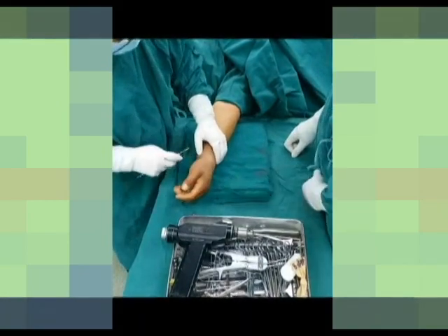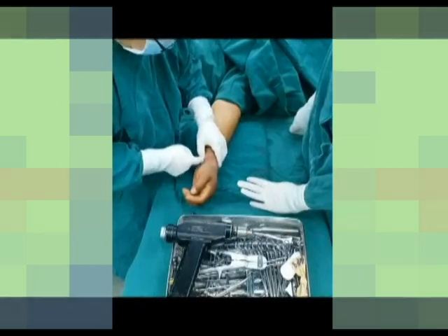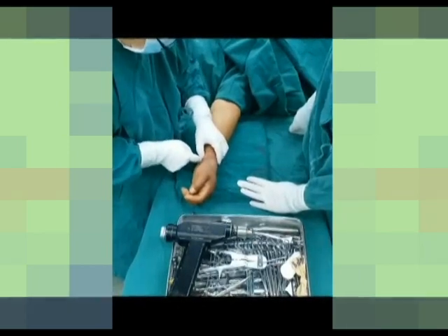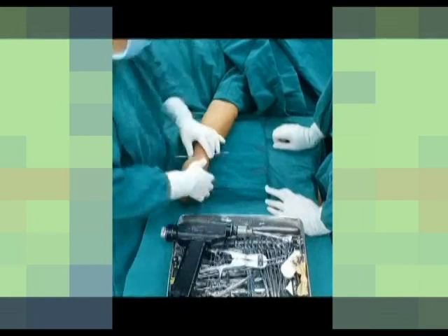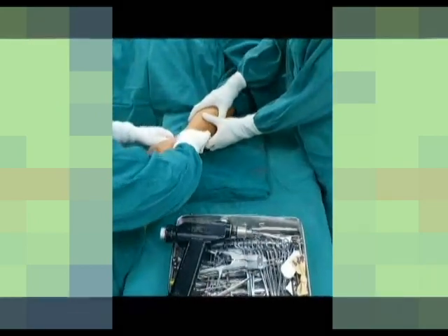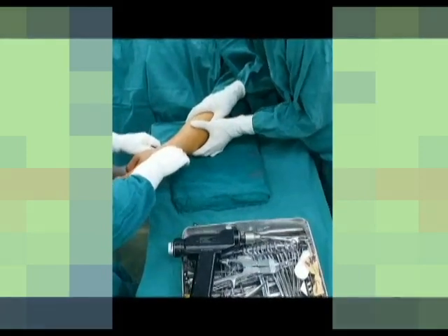We palpate the radial artery and distal flexor carpi radialis and insert a 2.5 mm K-wire in between manually at the fracture level. We feel the fracture line by sliding the K-wire on the volar surface of the distal radius. Then we advance the K-wire across the fracture site and insert it out of the dorsal skin. Care is taken not to injure the cephalic vein.